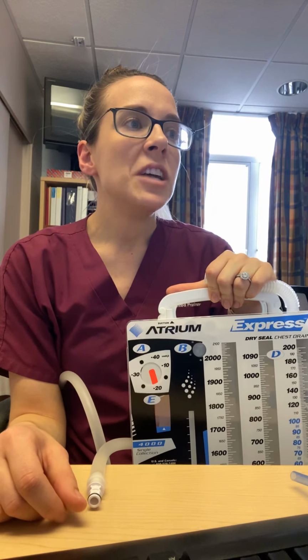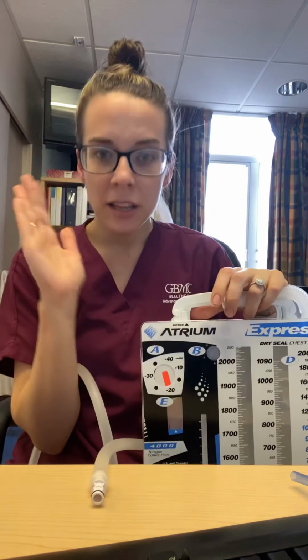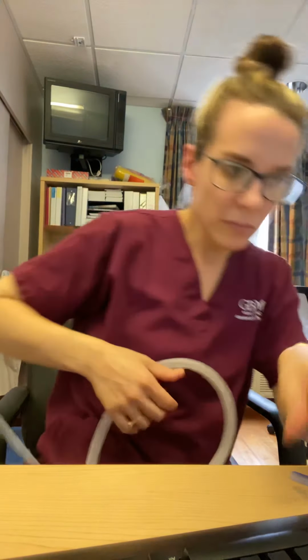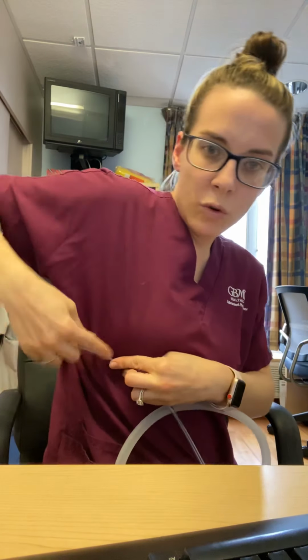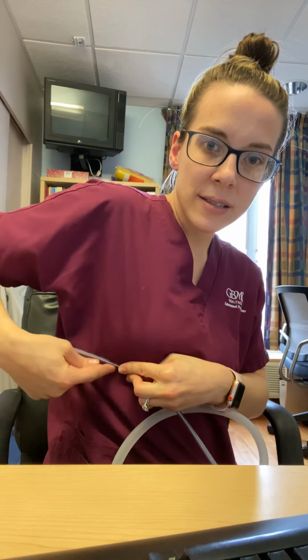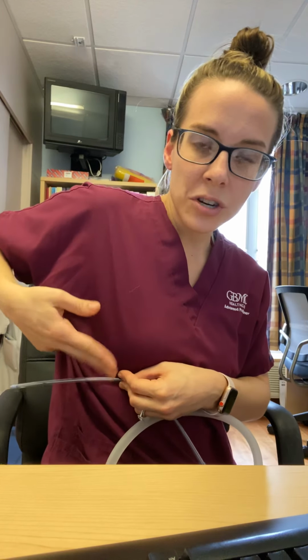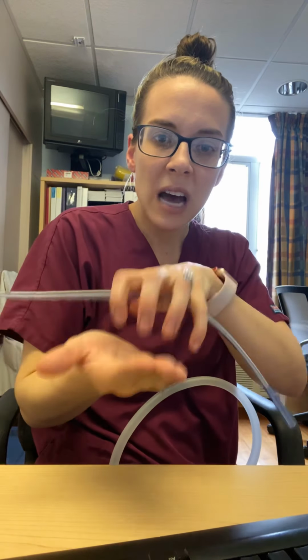I typically have the patient lay flat. I take the dressing down. The chest tube will be sutured in place here against the skin. So you're going to need your suture removal kit and cut the suture with scissors. And then I have my dressing ready to go. Tape and then 4x4s on top of the tape.